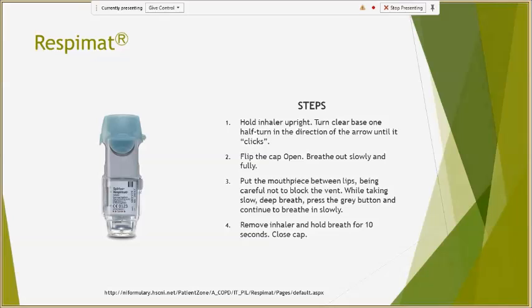There's quite a little rigmarole to prime the inhaler at the first use. So the TOP function has to be performed at least 4 times before the device can be considered primed. And the Respimat is not, literally speaking, a metered dose inhaler, and it functions somewhat like a nebulizer in the way that it aerosolizes the medications. It has the portability of a metered dose inhaler, but some of the mechanics of a nebulizer, so it straddles those delivery dosage forms.